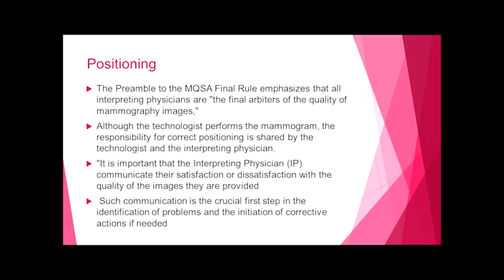This is what I need to do to improve that image. But it is a communication process, and it's crucial to the first step in identification of the problems, and then, of course, initiation of corrective action if needed.